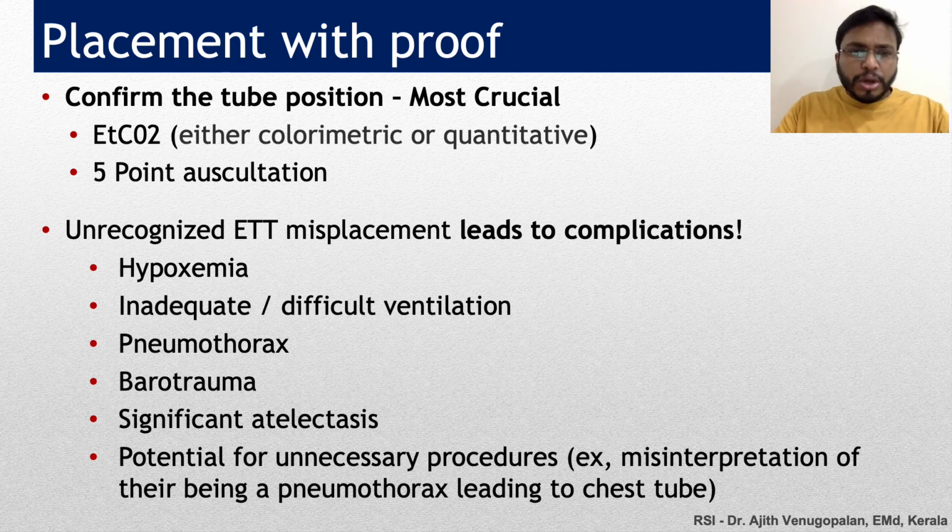So make sure that a misplacement doesn't happen. Make sure that you follow the steps of 5-point auscultation and EtCO2, and make sure that your tube is in position. Unless the tube is fixed, you're not to let go of the hold. That's the most important thing.